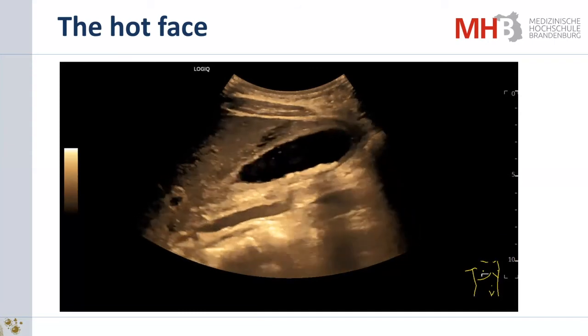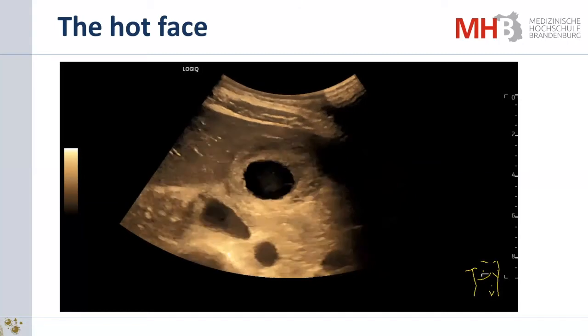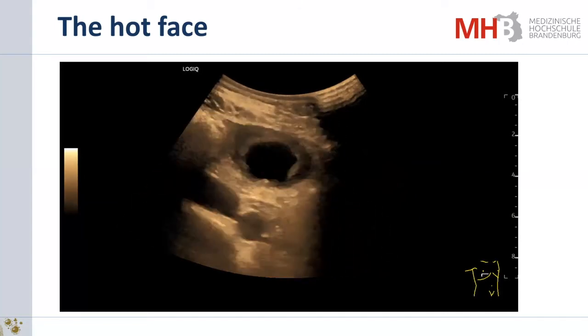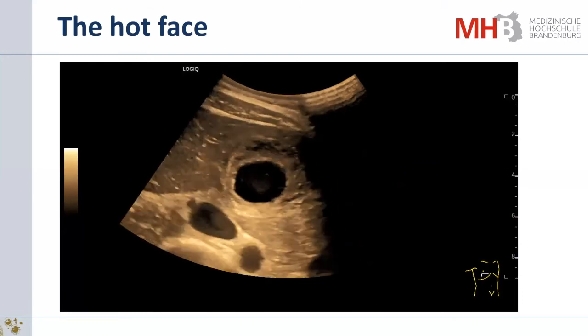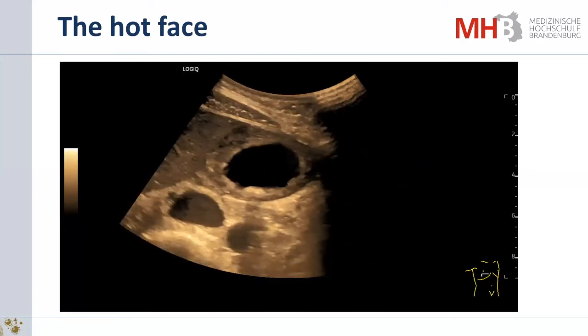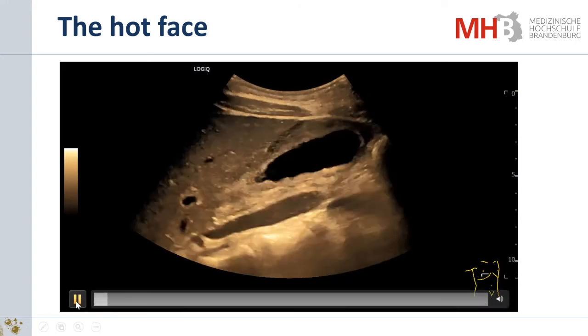and maybe that we now can use the chat. What you can see, what is not normal in this patient, and will help us to decide on the diagnosis of this young lady. Have you any ideas? Please write in the chat or tell it. We are only 20 people, and you can activate your microphone if you want. I repeat this.